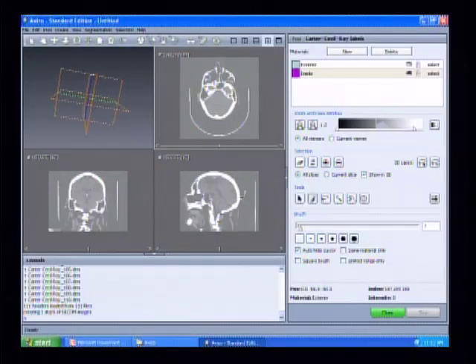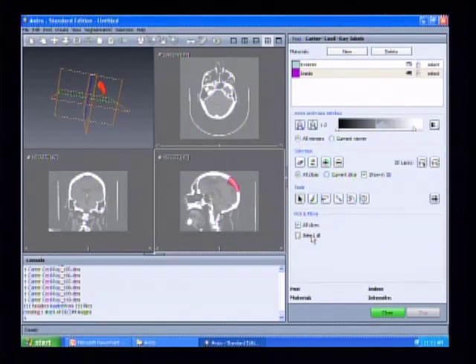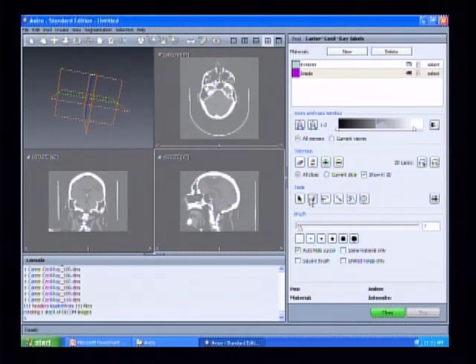What the brush tool will do is, if you have a boundary, you can just draw on your image and decide what you want. So, for example, if you were doing this by hand, which would be very difficult because it's not that accurate, you could add that to the crania, and you can see that you now have this purple boundary. But we'll unselect that since it's clearly not where it's supposed to be.